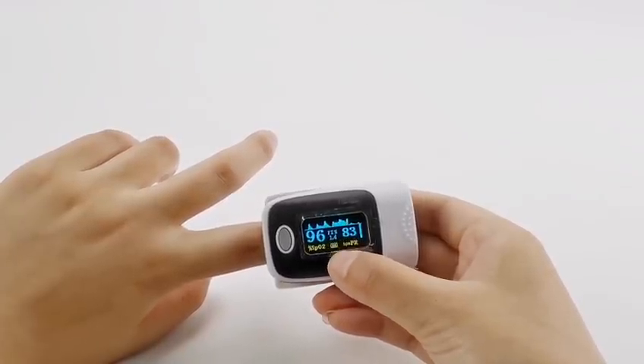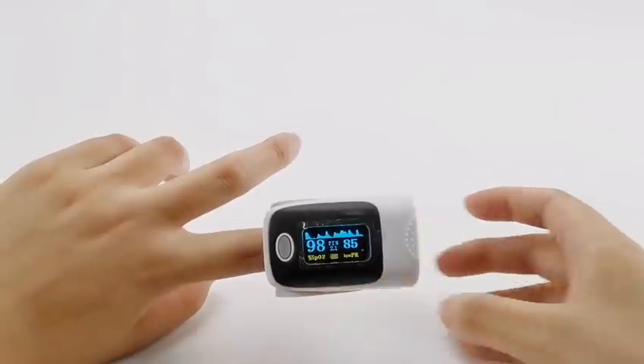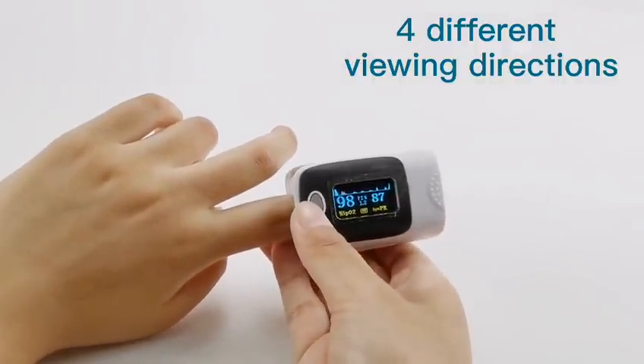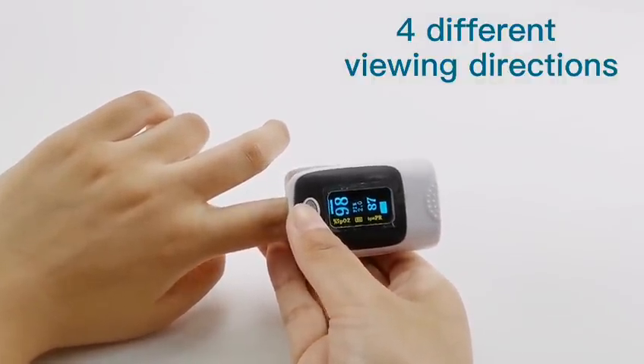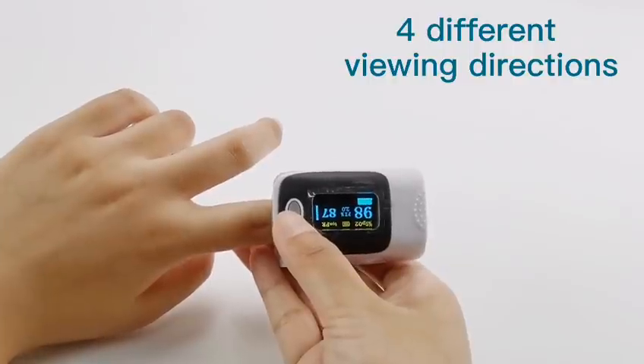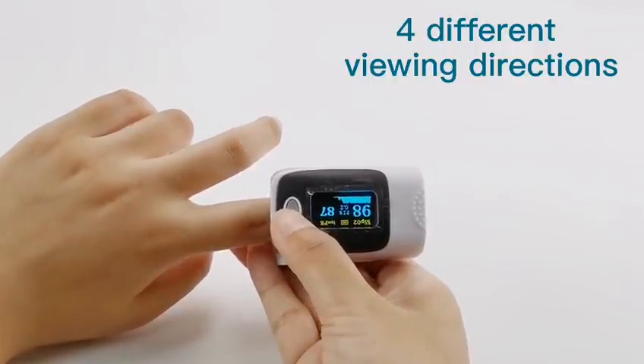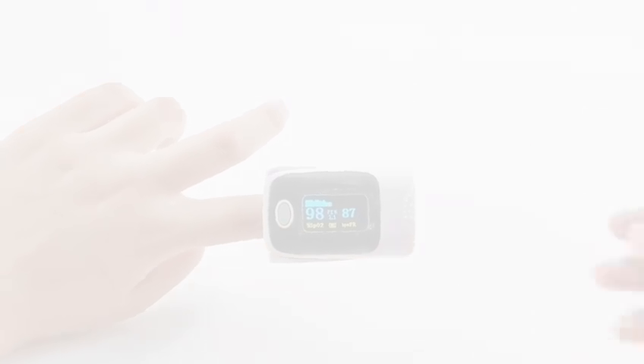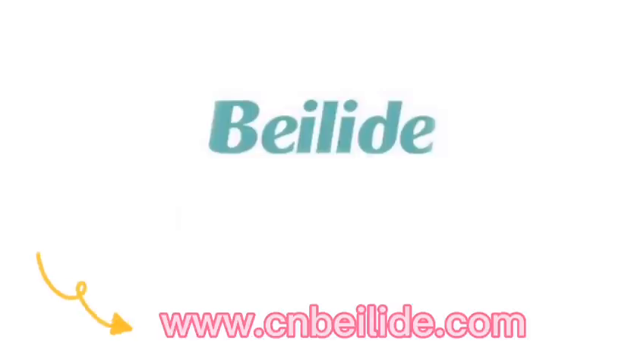Also, you can see the battery status. Tapping the bottom once gives you four different viewing directions for convenient readings. Always consult a doctor before and after use to discuss your health.